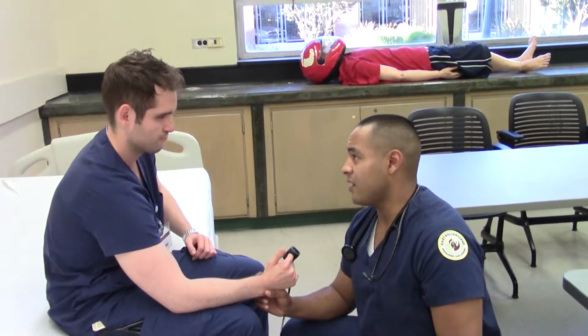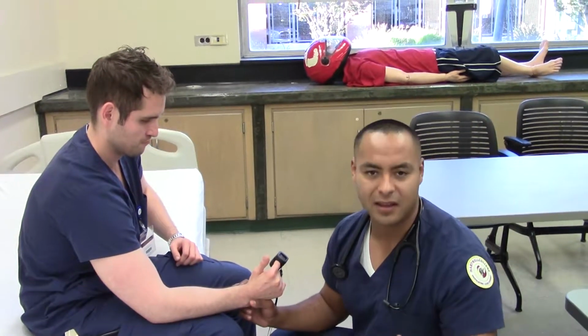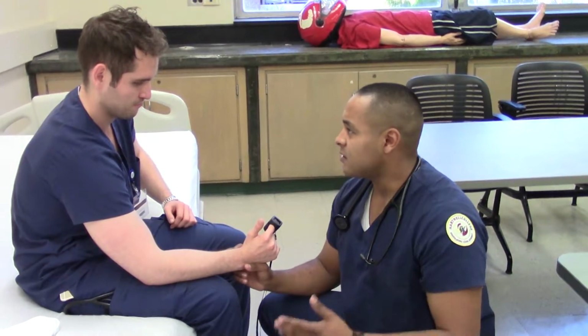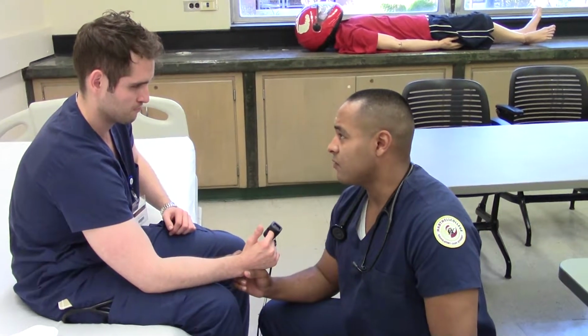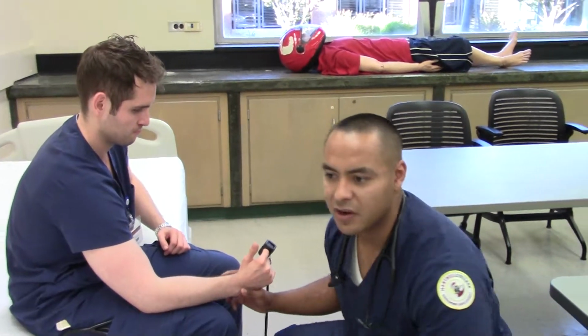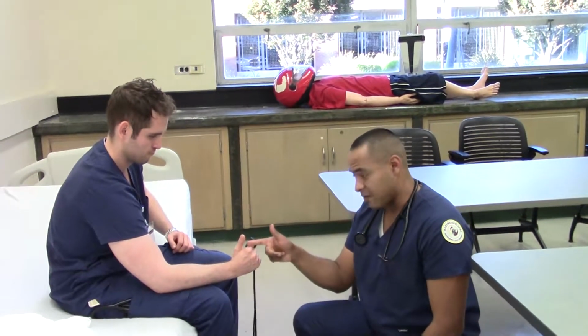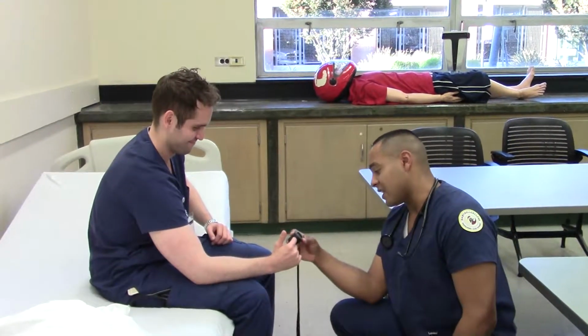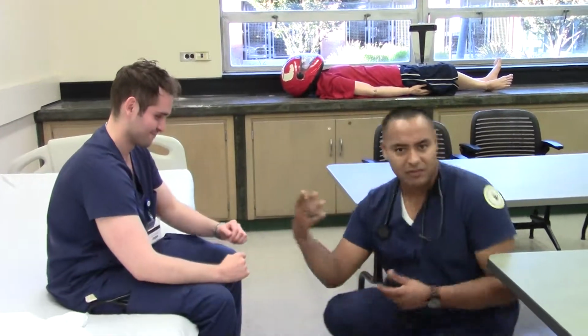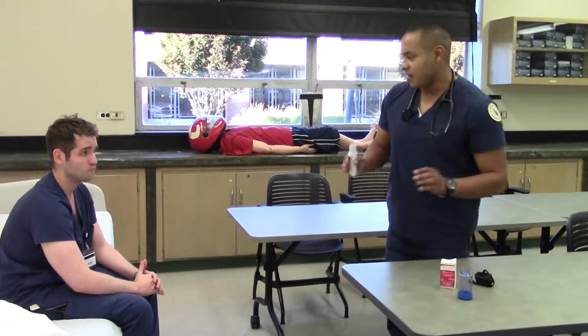So, let's say you're having distress, the pulse is above 100 right now, right? It's indicated. Hopefully it's not indicated, right? That'd be good to not see indication, but it's indicated, he has a high pulse. His BP was, let's say, 145 over 80. His pulse is 120, so he's tachycardic, he's breathing heavy. Thumbs up, that's a good sign. His pulse ox reading was 97. So that's good. So he's having a hard time breathing. His breathing is causing this increased heart rate. Okay. All right. So you're breathing kind of heavy, but it's fine now.